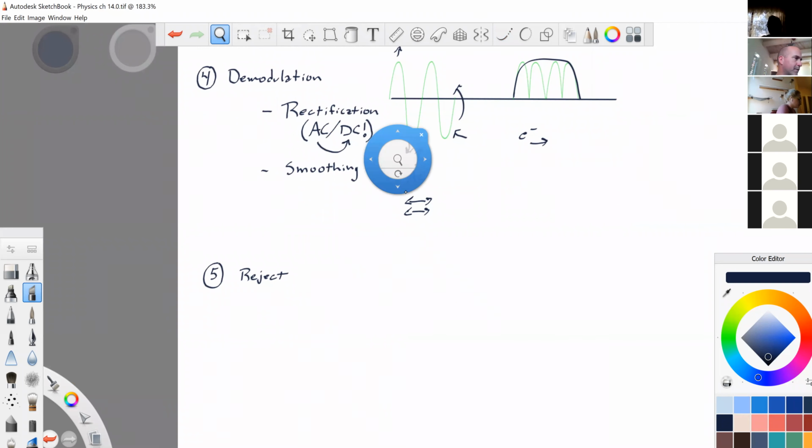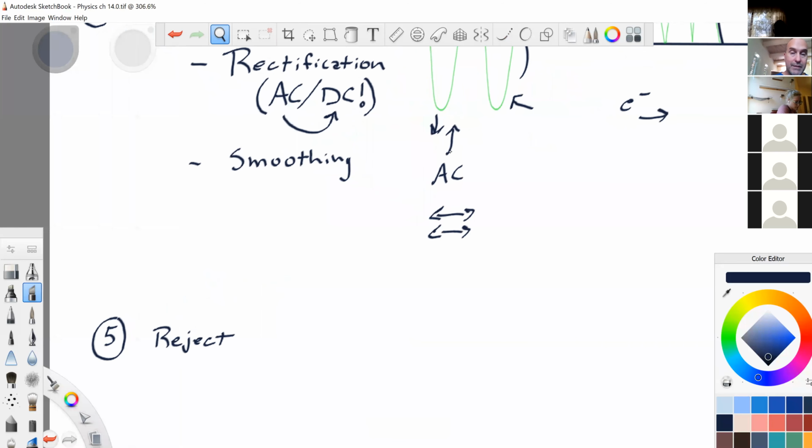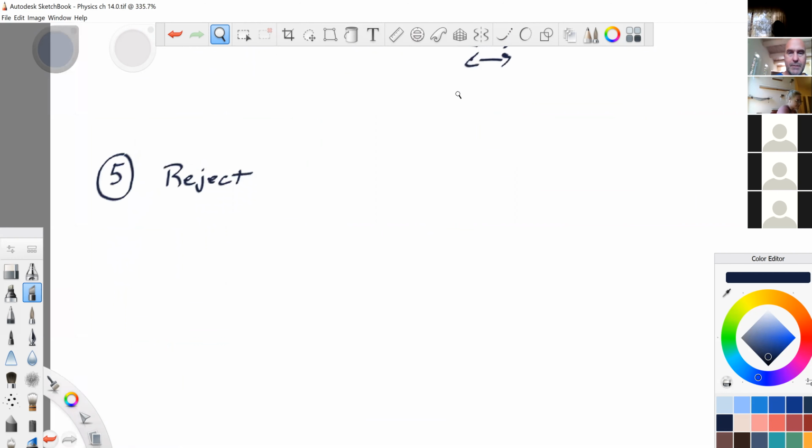Not adjustable. This happens in the background. No effect on the image. It's just going from regular voltage, AC voltage, to DC, and that's basically these steps. I suspect there's a lot more to it, but A, I don't know, and B, I don't care.